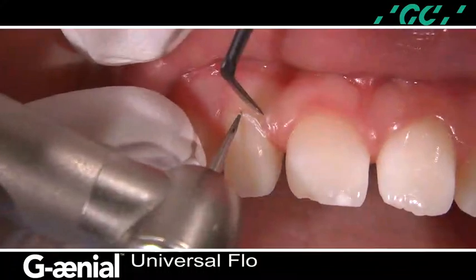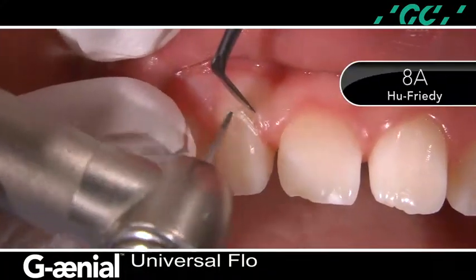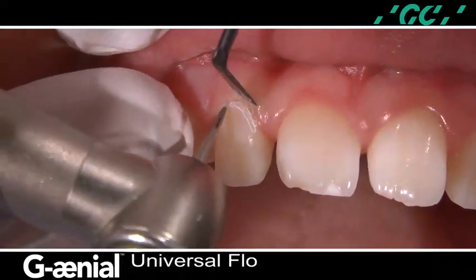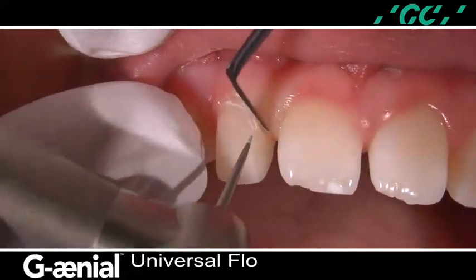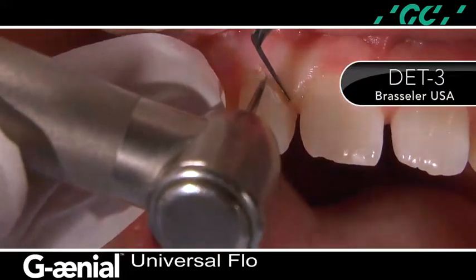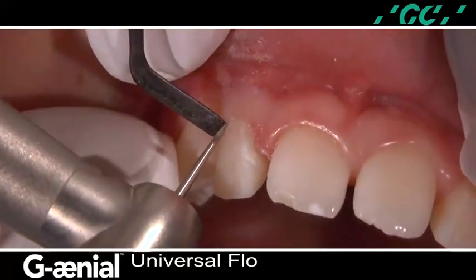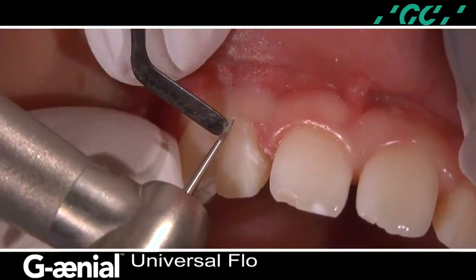The gingiva is reflected with an 8A instrument to prevent tissue laceration while developing the emergence profile. A short tapered diamond finishing burr, a DET3 by Brasseler, is used to finish the tooth restorative interface and maintain the natural anatomic contour of the tooth.